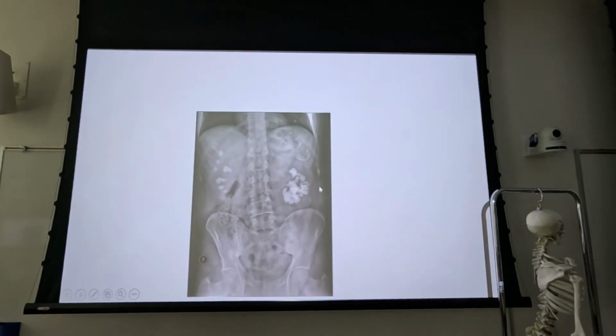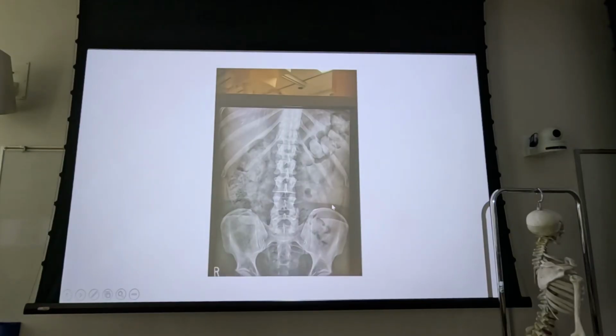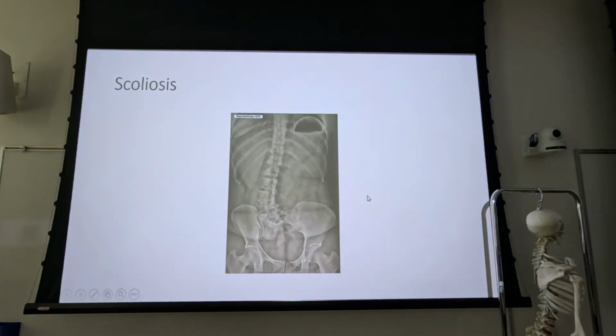I think we're beating the dead horse here. Any questions? This one I just had to include, because we've got a KU, we don't have KUB, but is that because of bad positioning, or because of bad photography? We don't need to see the rail system, we need to see the x-ray. So anyway, scoliosis, going to have rotation. Any questions?